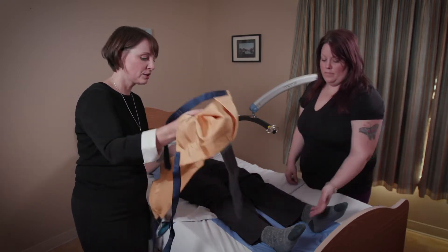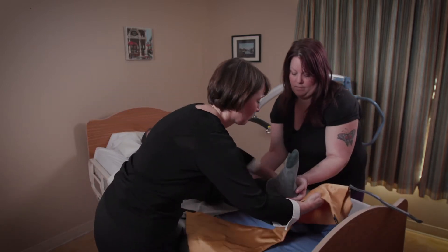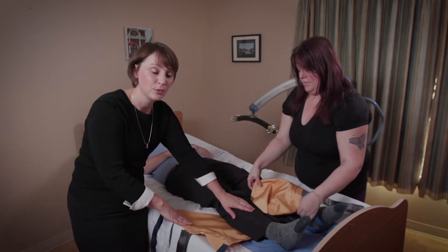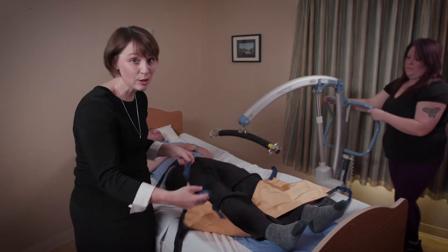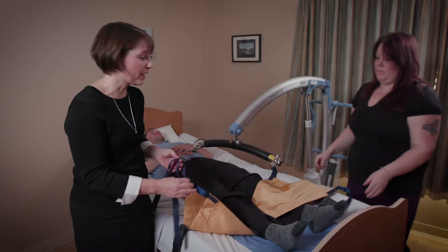So we're going to position the sling underneath Chris's leg, wherever it is that you need to position to do that care for the foot. Then quite simply we're going to put the lift into place and hook up the two straps at the lowest level, and elevate that to the appropriate height.